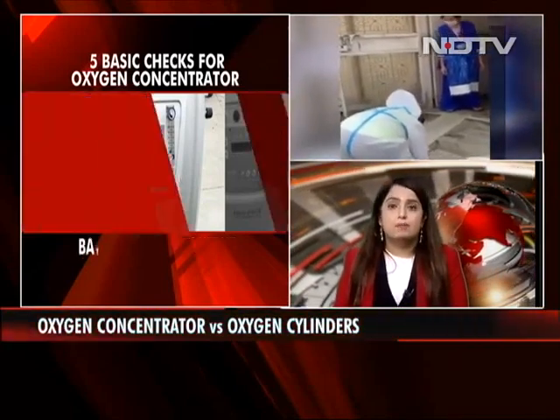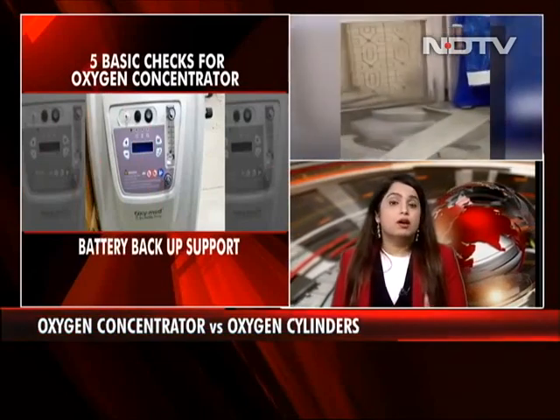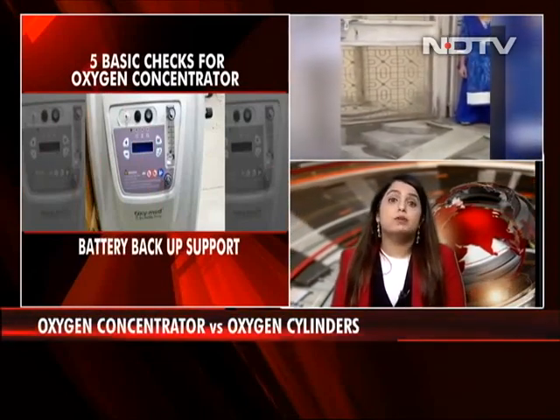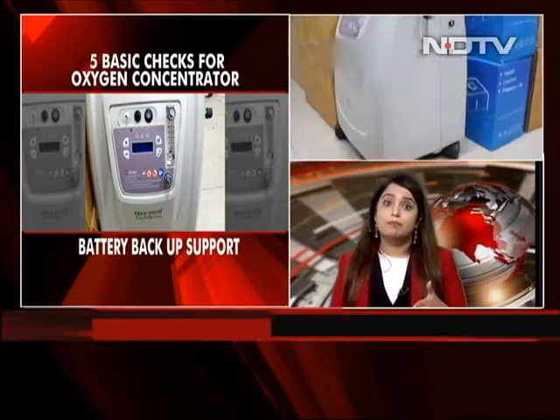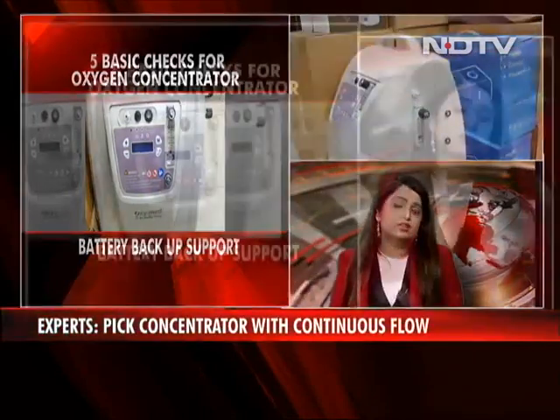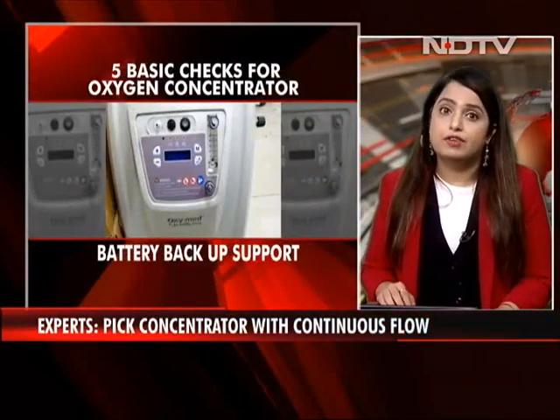Fourth, battery backup support. Now, you should look out for battery backup support, which can be found in portable concentrators. While this can be helpful if you have an erratic power supply, these concentrators are often rated only for 3 to 5 liters per minute.